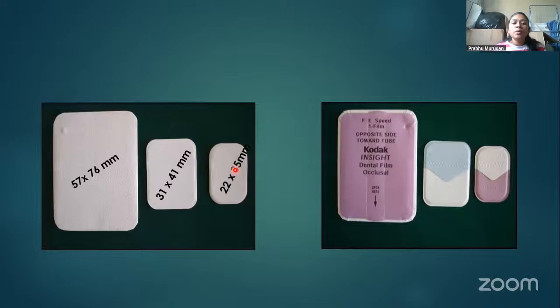Yep. So moving on to the size of the X-ray films. The one that is smaller here, right? The smallest one, that is 22 into 35 millimeters. That is your pediatric film size. Then your 31 into 41 is the ideal IOPA film size. 57 into 76 is your ideal occlusal X-ray film size.